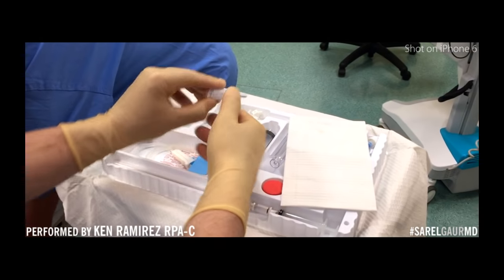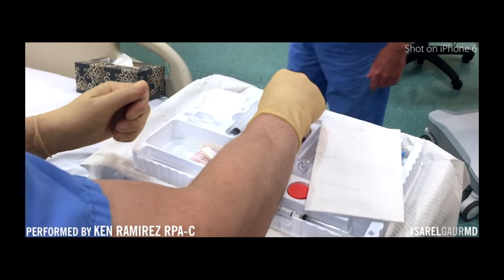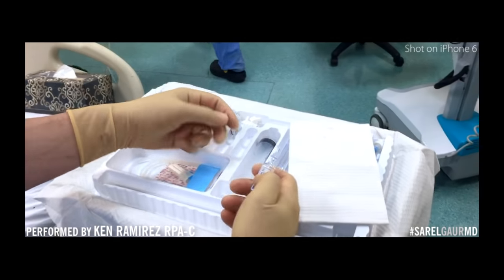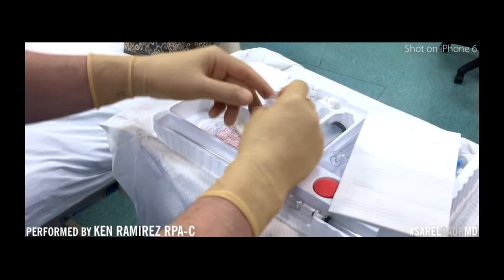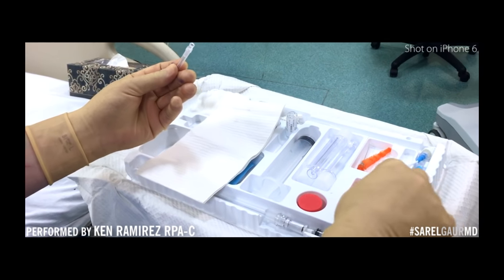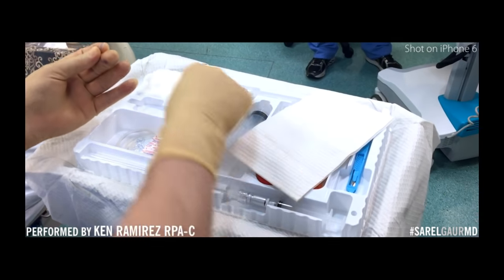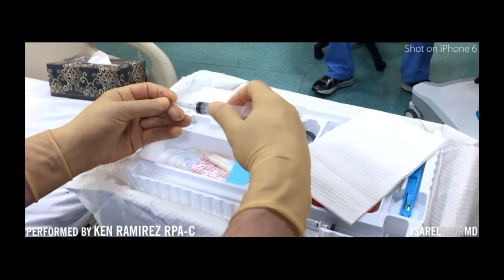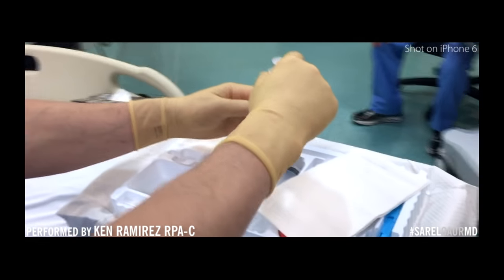We have lidocaine, and lidocaine is going to be for local anesthesia. They give us a drawing needle that has a filter in it in order to trap any shards from getting into the syringe.